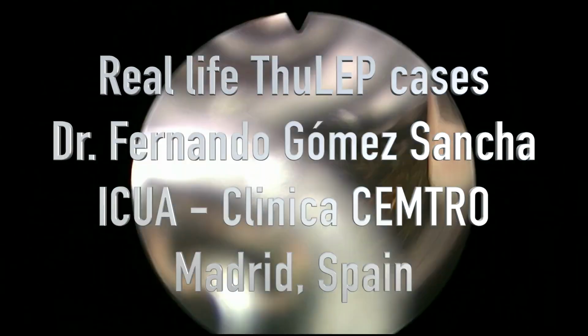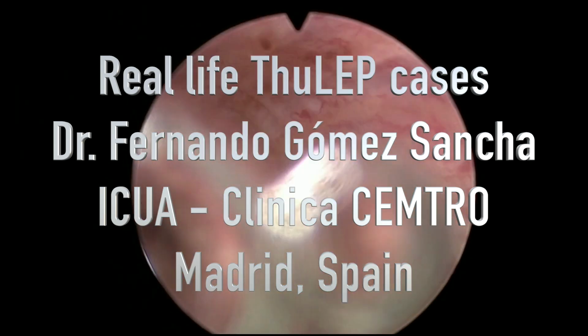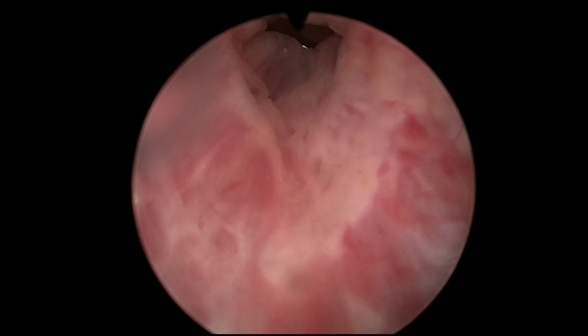And I'm very interested to explore how this different wavelength to what I'm used to, which is holmium laser or holmium lasers, will affect the way we perform enucleation.